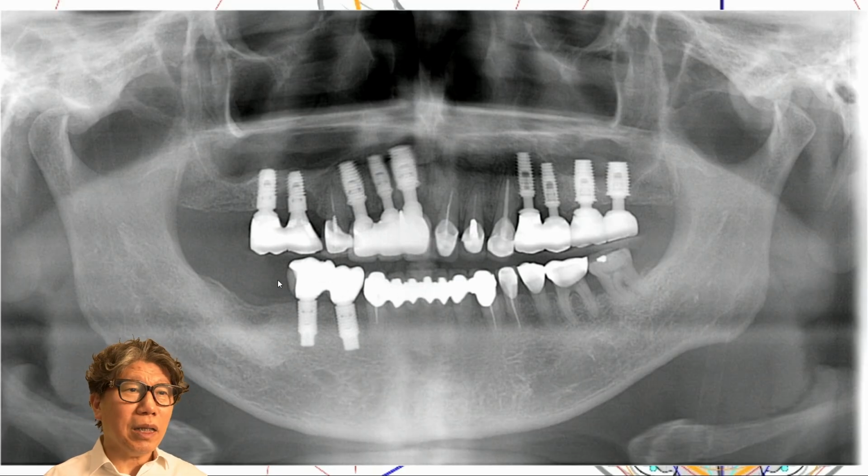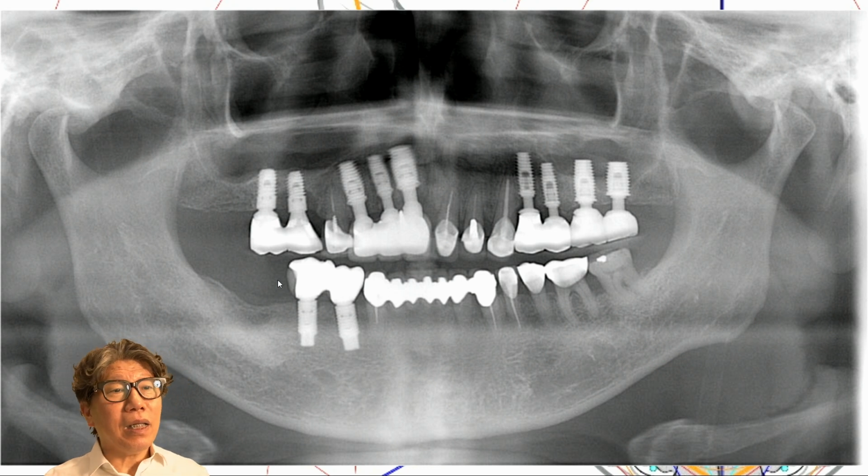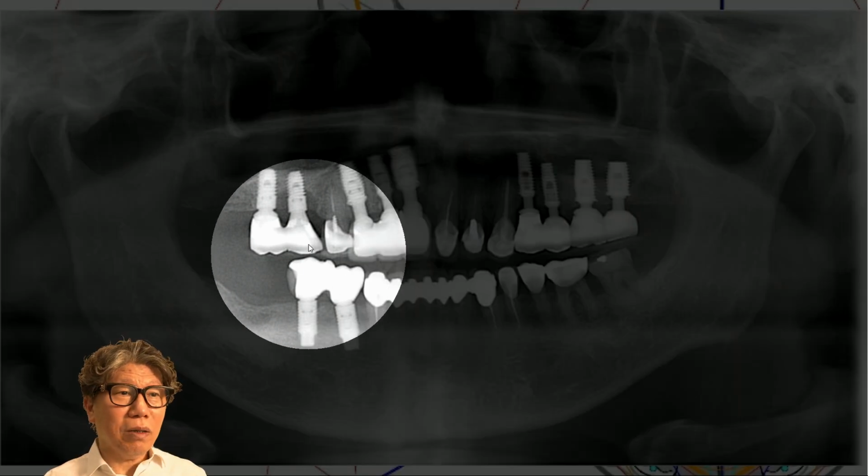It is a bit difficult to understand immediately. In my opinion, the timing of the implant surgery might have been different. The maxillary teeth have risen. After leaving the extrusion untreated and performing implant treatment, an occlusal curve step developed following the extraction of the opposite tooth and subsequent implant treatment.